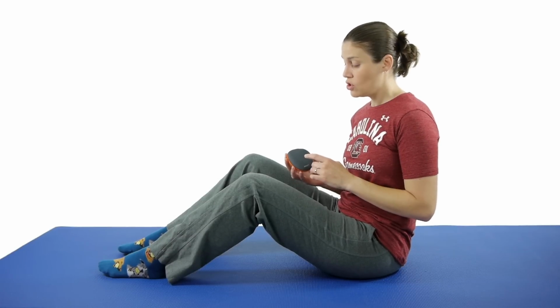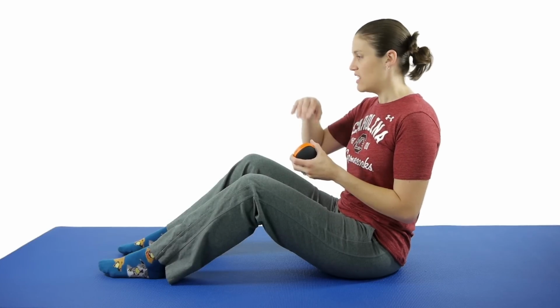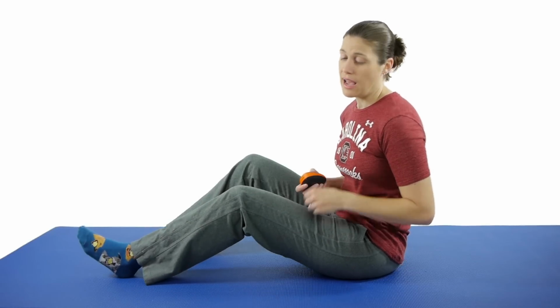So a great way to know how much you're pushing is to use specific tools. This is called the Active 5, and it's a really neat piece of equipment because you download the app on your phone and it'll show you how much pressure you're putting on this. So you basically put it wherever you're pushing into and it'll let you know. And the app has some really cool games you can do with it, where you put your max rep in there and then it'll give you a line you have to follow, so you push harder and less, which is really cool. So what I'm going to do is just show you some of the isometric exercises and use this throughout so you can see how to use it.